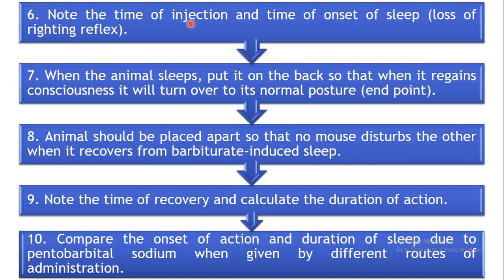You should note the time at which you are administering, and the time at which it starts showing the action. That is, as I have told you earlier, pentobarbital sodium is a sedative hypnotic, so it can induce sleep. So this is our parameter. You need to check for how long the animal sleeps and at what time it begins with that particular sleeping parameter. So what is the time of onset of sleep?